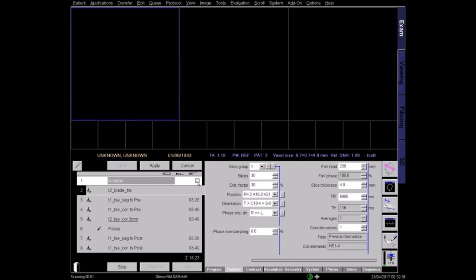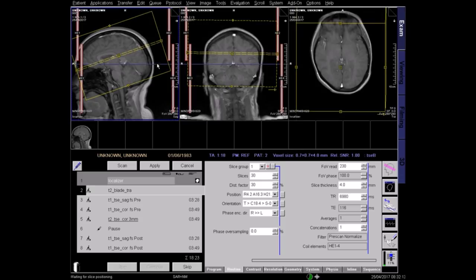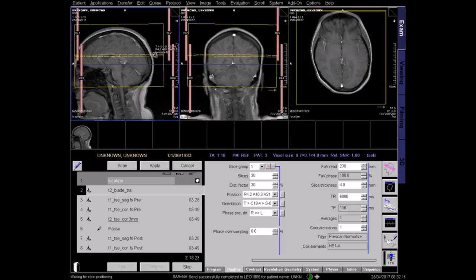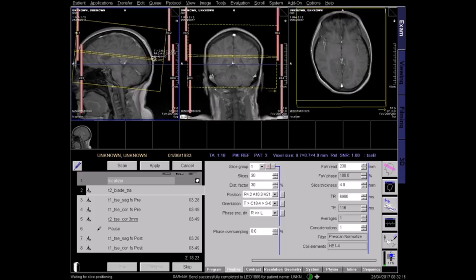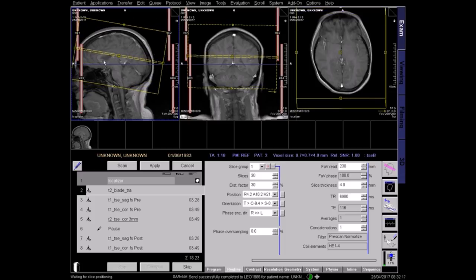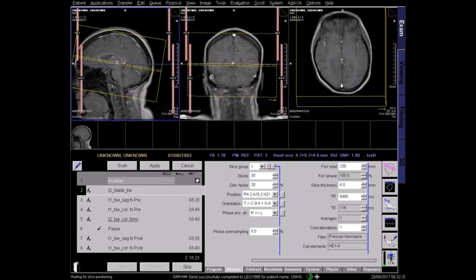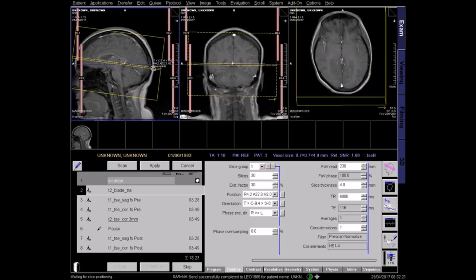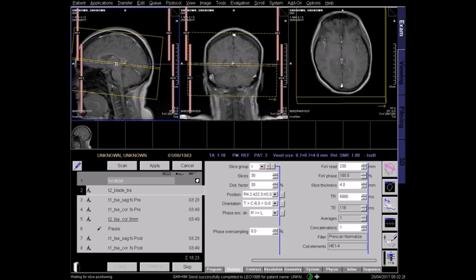In this protocol, the first sequence is a T2 axial brain. On the sagittal localiser, plan your axial slices, running parallel to a line joining the inferior border of the genu and the splenium of the corpus callosum. Make sure the whole brain is covered, from the vertex superiorly to the foramen magnum inferiorly.